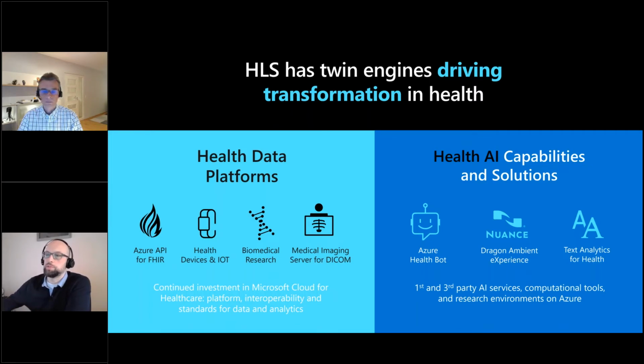There is a similar story with what we refer to as the service for DICOM. DICOM is this standard for medical images. So these are many of the images that you have seen so far and that you will see more of in these demos. And medical imaging is a space big enough on its own that we have a special focus on that.